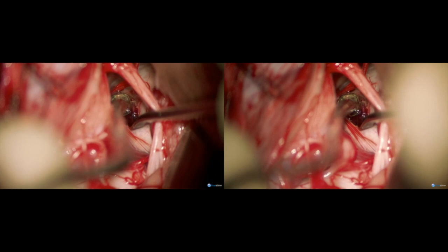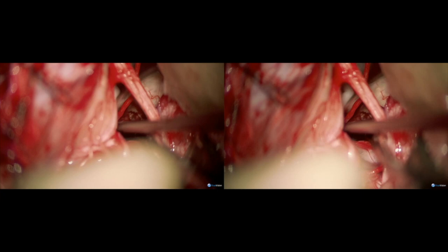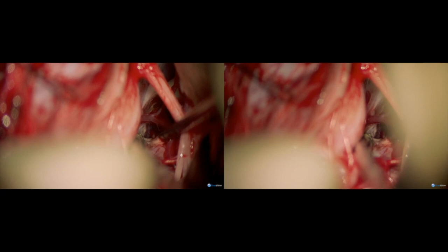A ring curette can be used to bluntly start dissecting the cavernous malformation from the surrounding brainstem parenchyma. In contrast to the dissection technique in other less eloquent areas, the use of the bipolar cautery should be limited. Once a plane has been established between the cavernous malformation and the surrounding parenchyma, a variety of instruments can be used to start developing this plane. This includes spreading of the bayonet forceps or the use of a pial dissector from the Rhoton set. Once this plane is further developed and an edge is available, the dusted diamond tip of bayonet forceps is a very useful grabbing tool, and the use of traction-countertraction technique with the dissector can be very useful in further developing this plane.